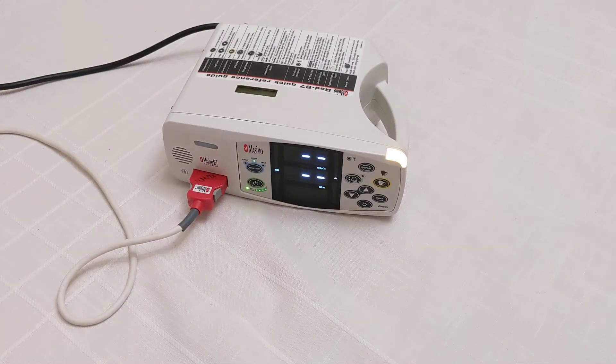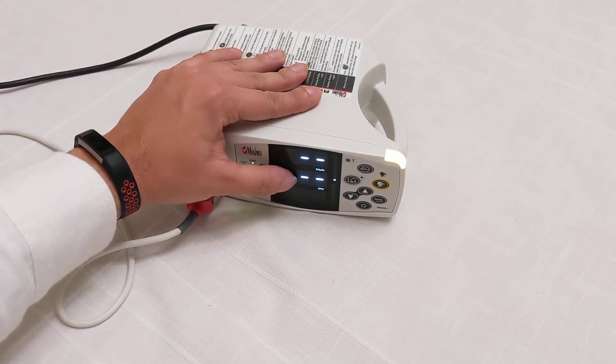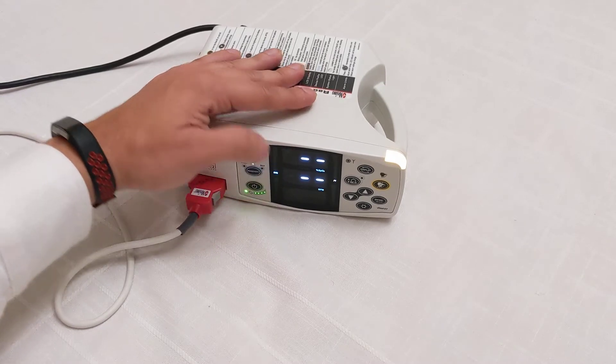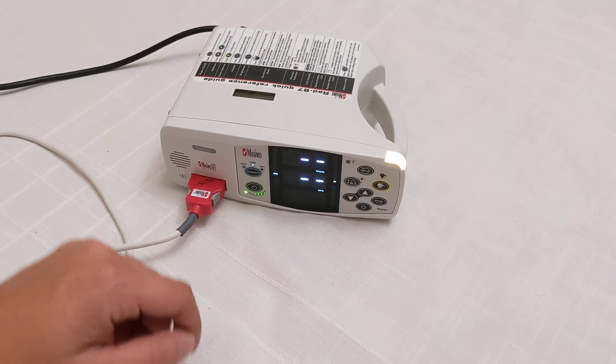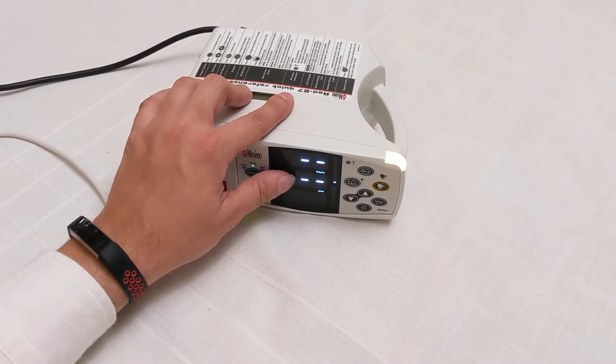This is a video about how to set your Masimo Rainbow Technology RAD 87 settings. There are two slots on this monitor: the top one is for SpO2 percent, which is basically how much oxygen is reaching your fingertips — they call it saturation. The bottom one is your beats per minute.